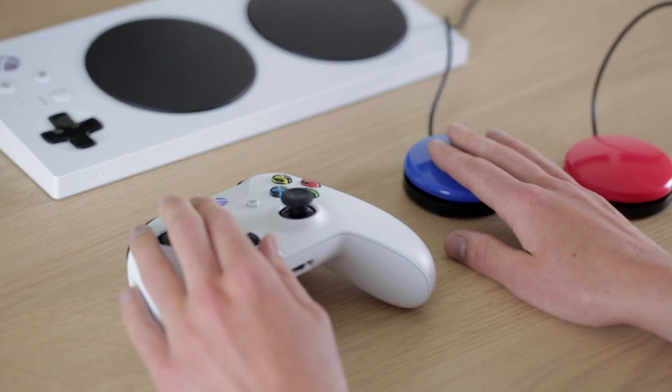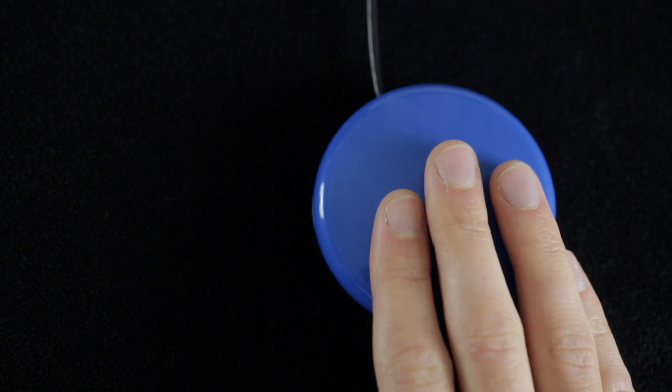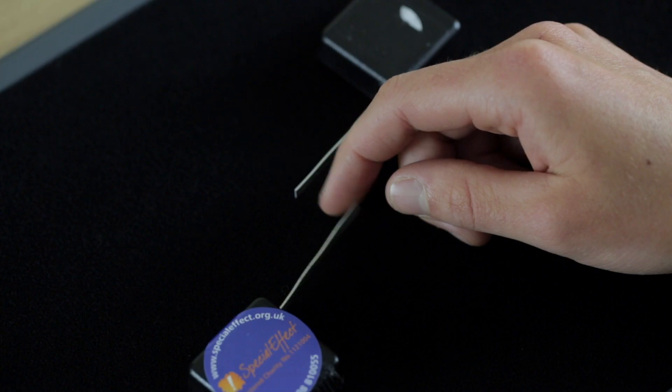Here at Special Effect we use a range of different switches for the people that we work with. The type of switch that we use depends entirely on the amount or type of functional movement that the individual has.